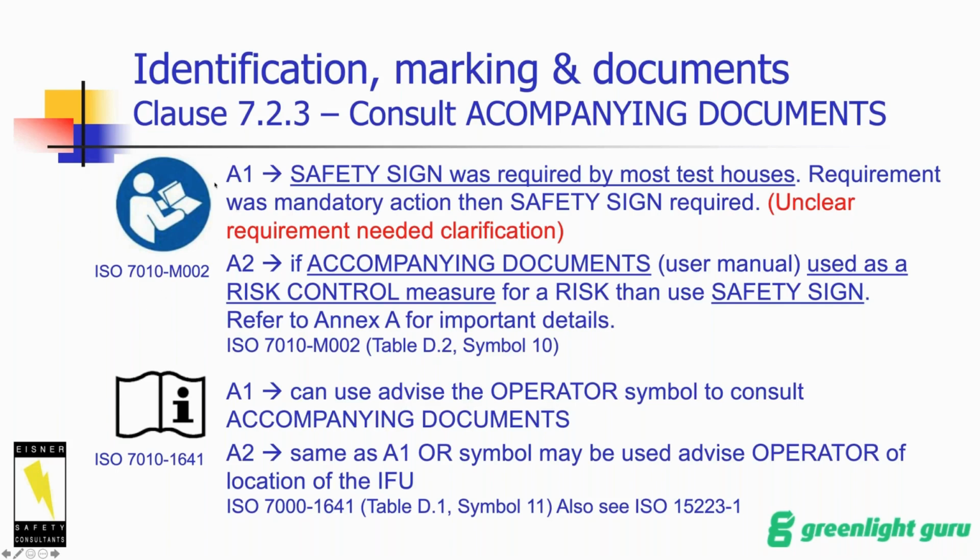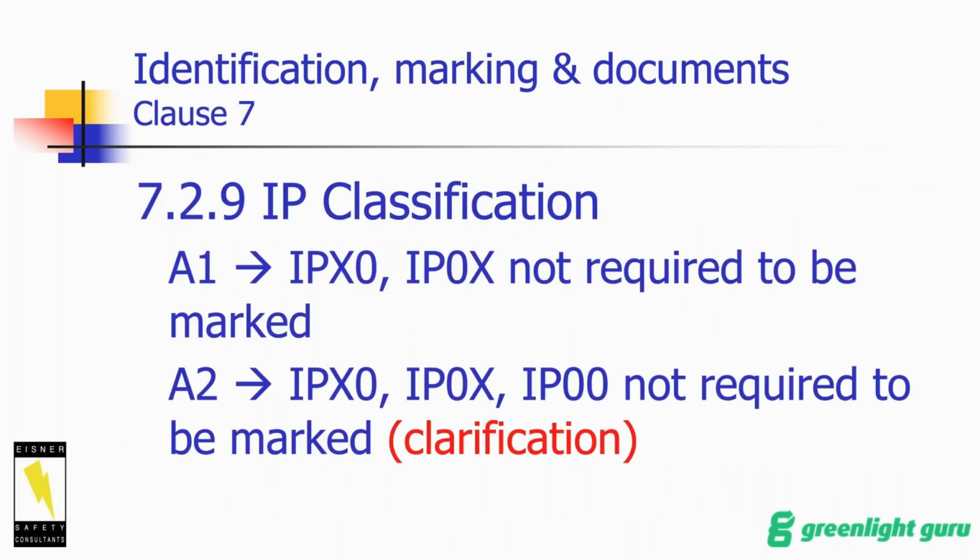And when you have a sterile pack and you have this symbol on it, there was the argument, does it have to be black and white with this instead of blue and white? That became a mess in itself. So I'm glad we finally came to this clarification. There's a really important note in Annex A that you want to read as well. This clarification is very minor, so I'm not going to get into it today, but you should read it as well, of course. There's always lots of notes in my slides.